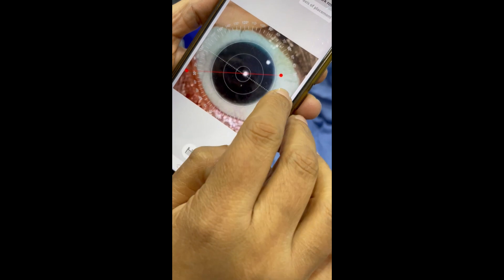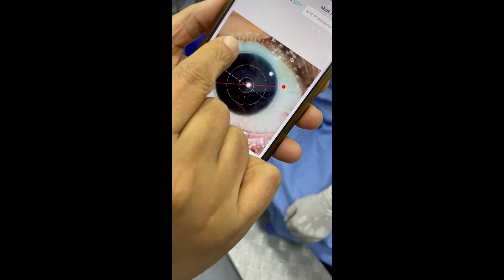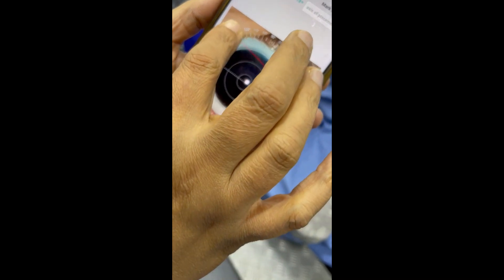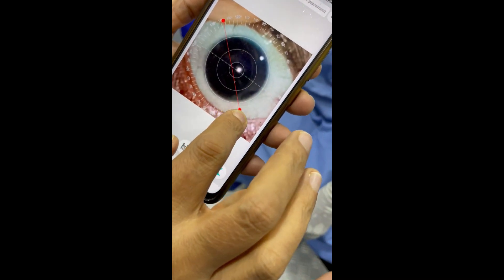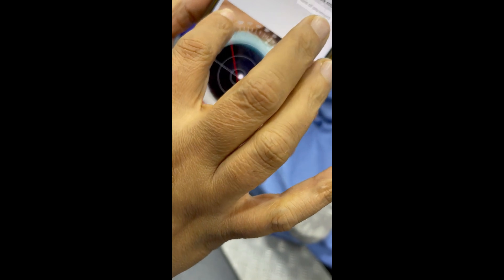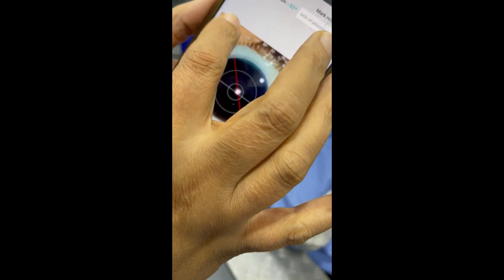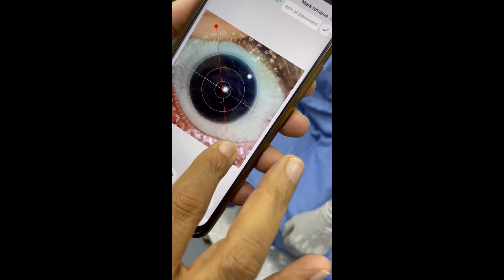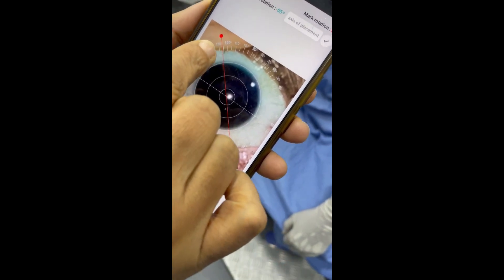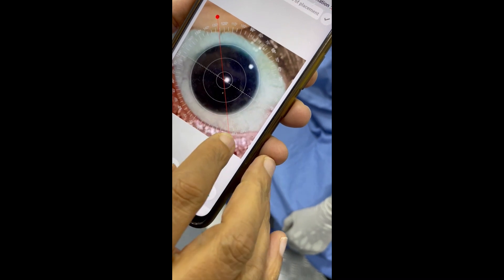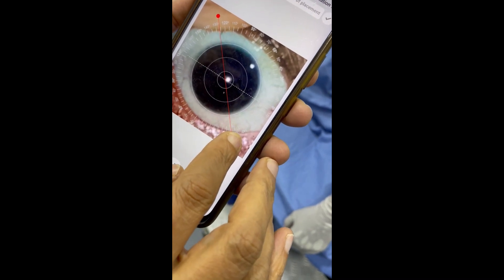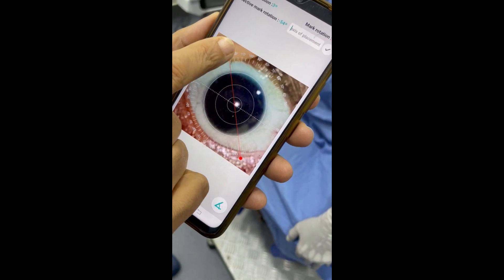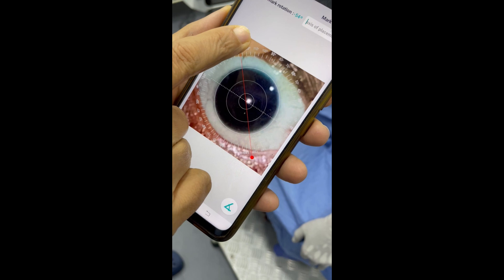That is the first marking. The second marking is preferable if it's exactly on the opposite side. However, I am showing that we'll choose this blood vessel in the supero-temporal quadrant, which is more prominent. We align the protractor so that it dissects that blood vessel and dissects the central red dot. Here we are getting 127 degrees for this upper blood vessel.